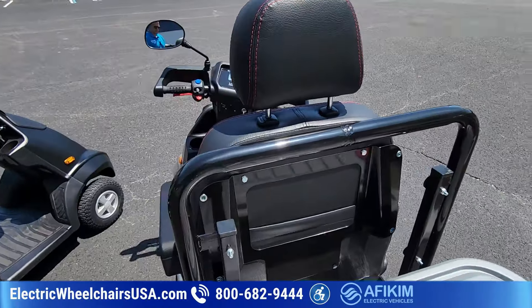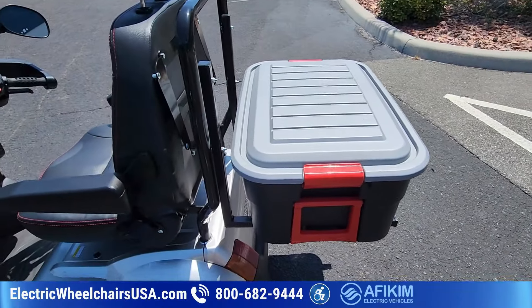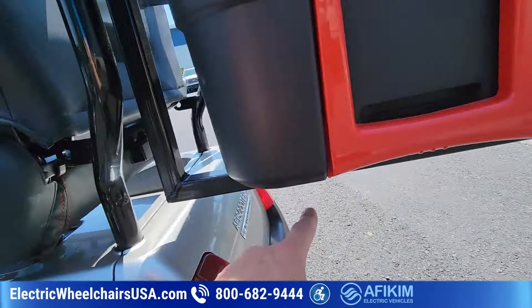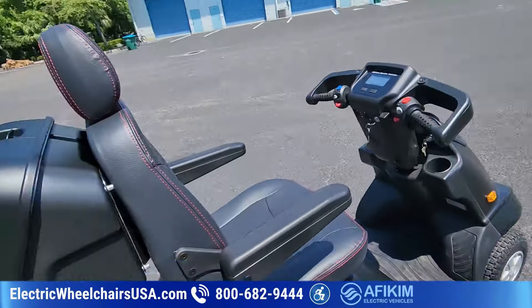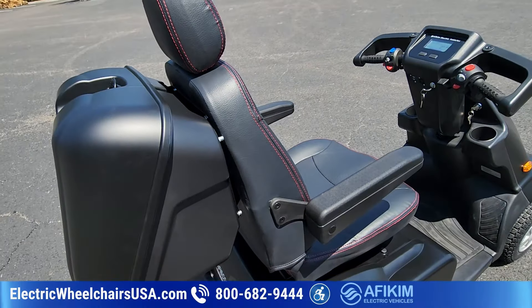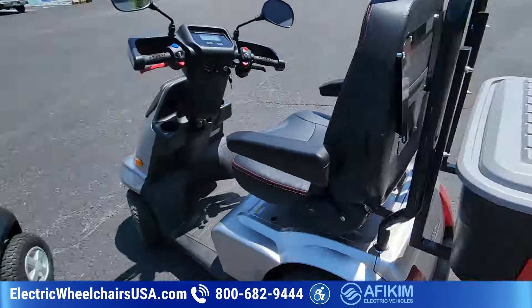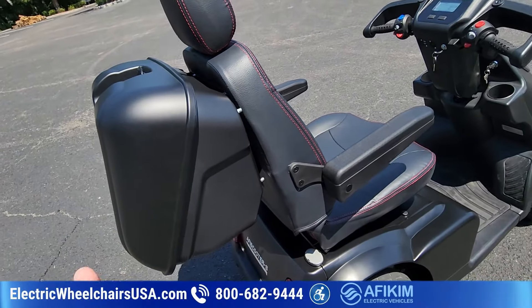An important note: when you have the storage tote in the back, because of the L-shaped bar it hangs on, you can't swivel the seat. With the lockable storage compartment that comes standard, you can swivel the seat. So if seat swiveling is important to you, you might want to consider not getting that tote upgrade — you still have storage, just not as much, and then you can swivel the seat.